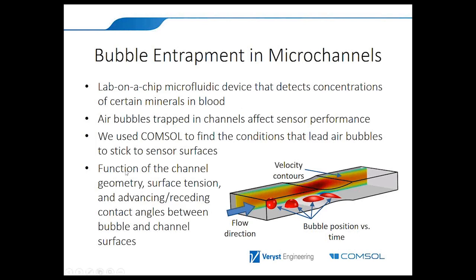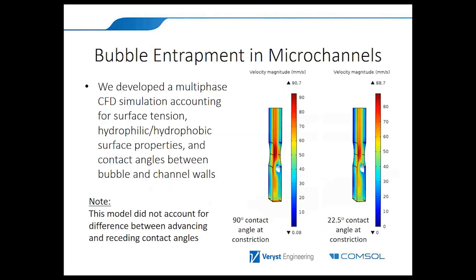So that is a function though of the geometry, surface tension, and the contact angles between the bubble and the different parts of the channel. So we did these two simulations, one where there's a 90-degree contact angle at the constriction here, and the bubble will not stick, it will keep going. If the angle is much smaller, then you will have the entrapment. The bubble will get trapped here. And that is not even accounting for differences between advancing and receding contact angles. In some cases, I know that you can have analytical estimates to determine whether the bubbles will stick or not. In some cases, you need simulation. And my colleague here at Veryst, Matt Hancock, is an expert in that area.